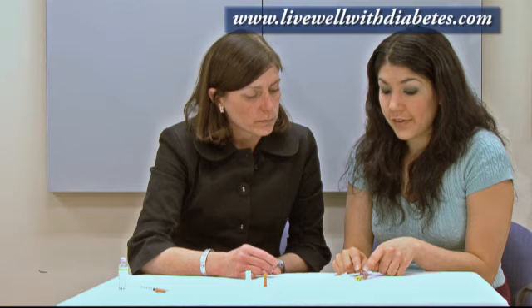Once insulin has been drawn into the syringe, if for some reason you didn't end up using it, you cannot put it back into the cartridge. If you pulled it out and didn't need it, just waste it and discard it.